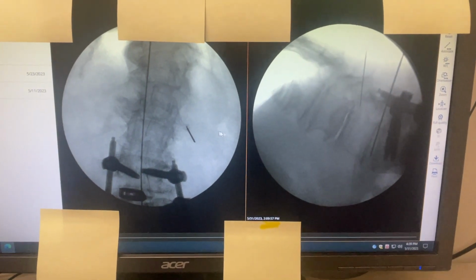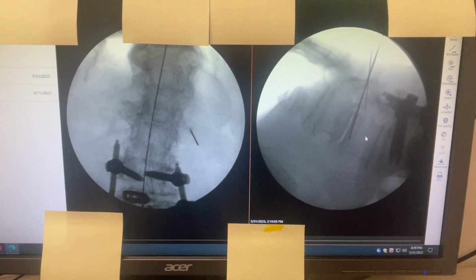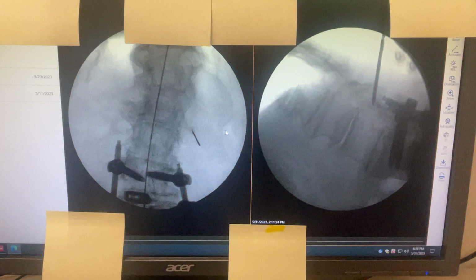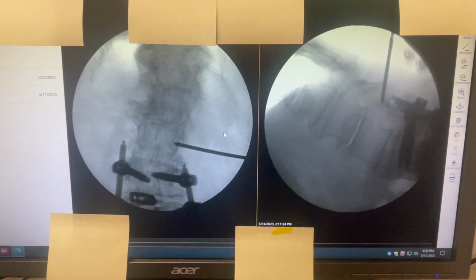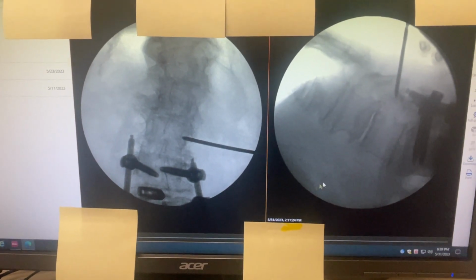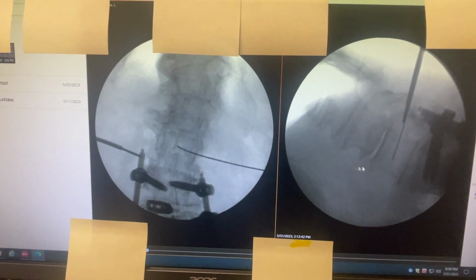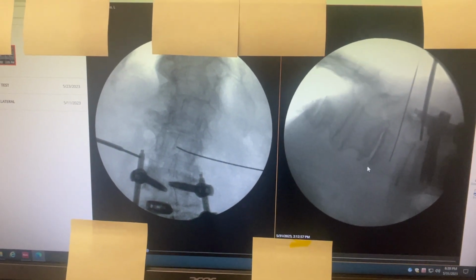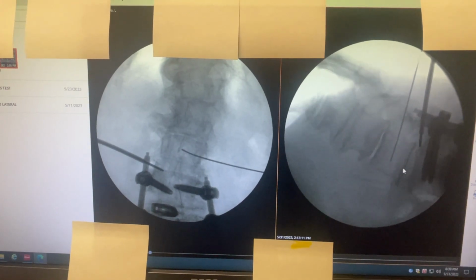This is the marking of the midline and disc trajectory on the skin, and then we enter the vertebral body to get bone marrow. You see the surgery start at 2:11, and now we enter, get the bone marrow, then we go with the probe, and we enter the Kambin triangle. This is an OLLIF. You see the location.